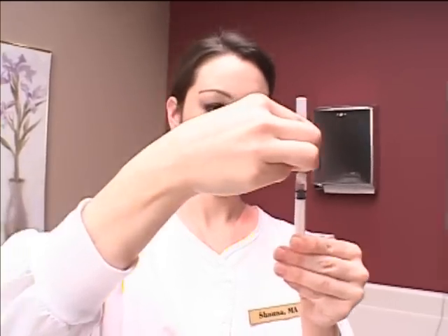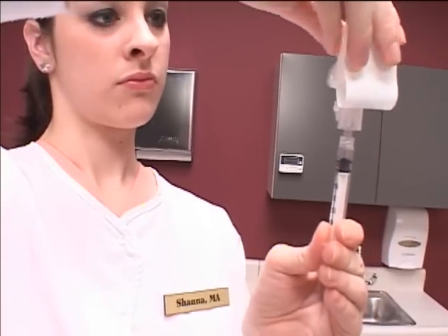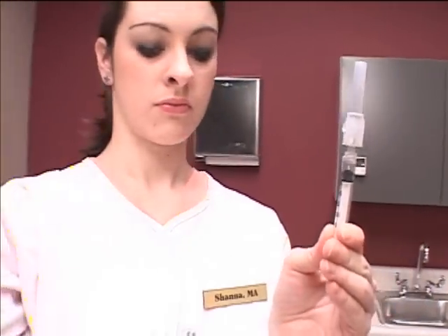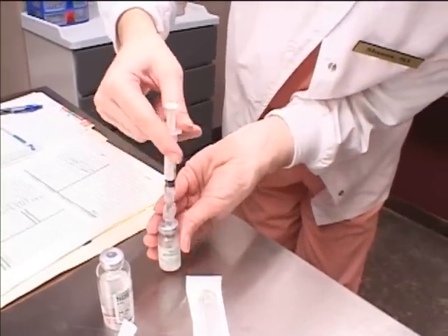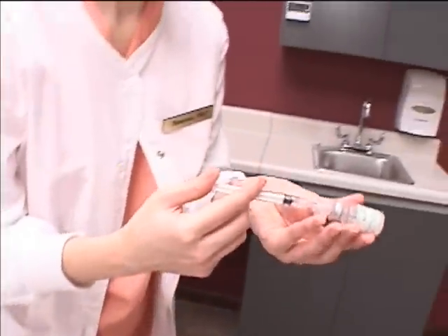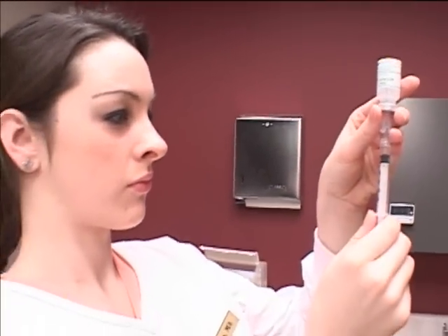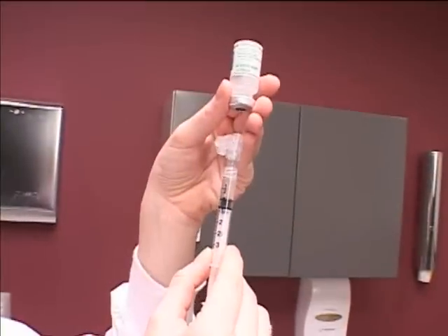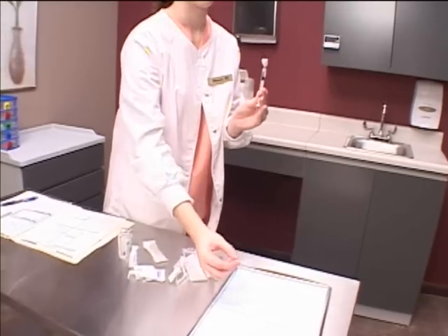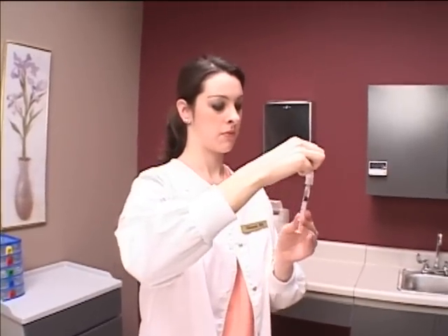Change your needle. This will help to reduce the risk of medication from the first vial mixing into the second vial. Insert the new needle into the second vial. Invert the vial and gently withdraw the medication from the second vial to the volume in milliliters equal to the total of both medications added together. Remove the syringe from the vial and follow the institutional policy regarding the recapping of needles.